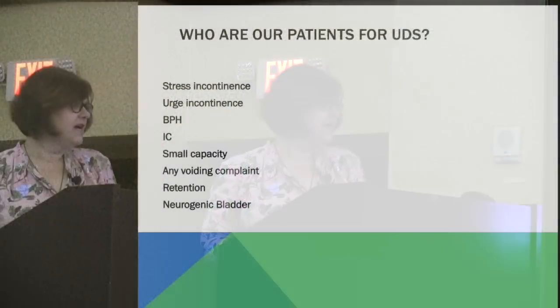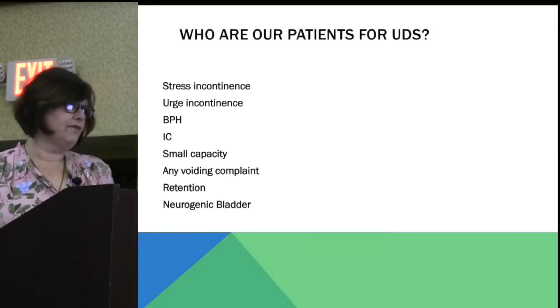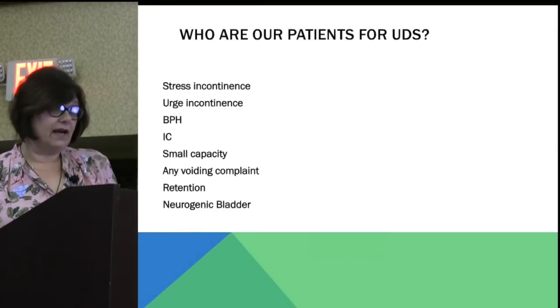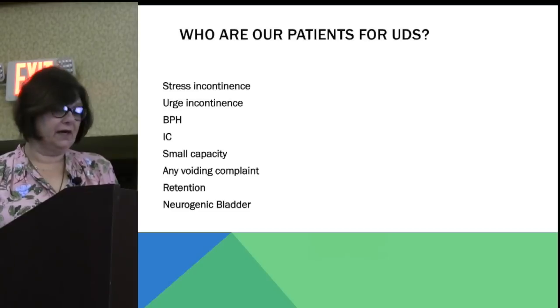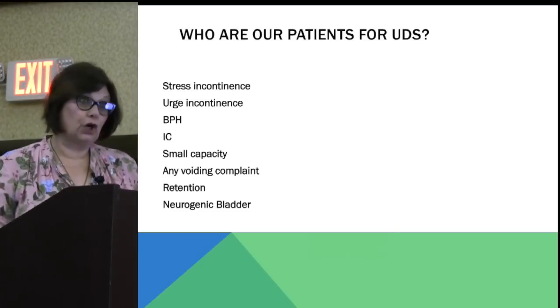So, who do we see for urodynamics? Why should our providers ask us to do these? It's people who are complaining of stress incontinence, so I leak when I cough, laugh, sneeze, or urge incontinence. I can't get to the bathroom quick enough. I constantly have to go. I wet myself. It hurts.